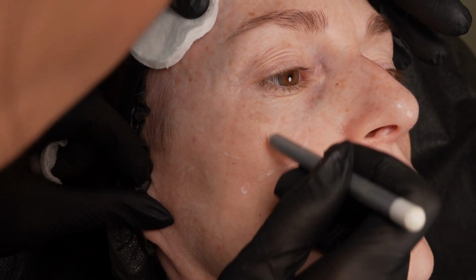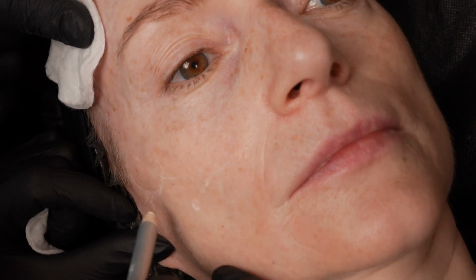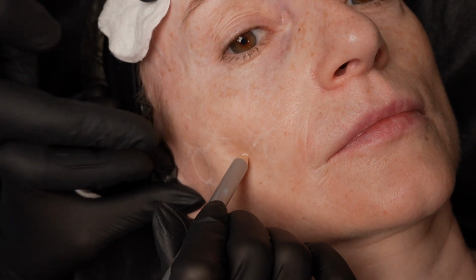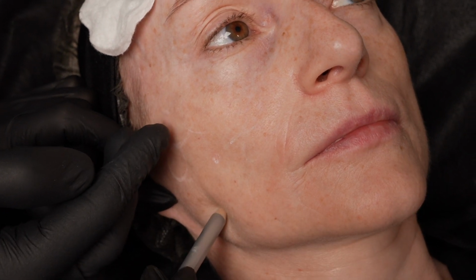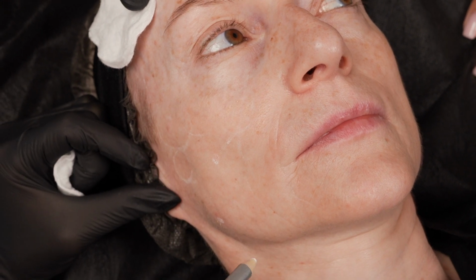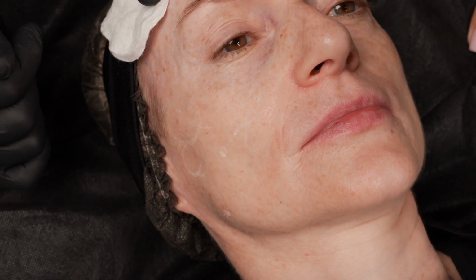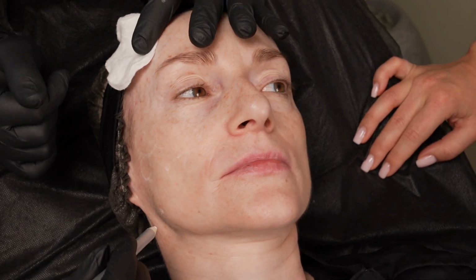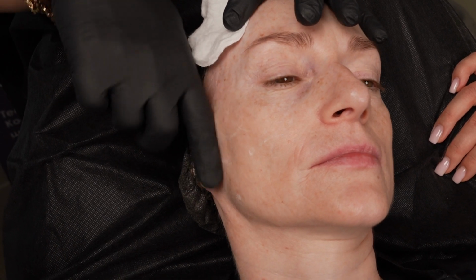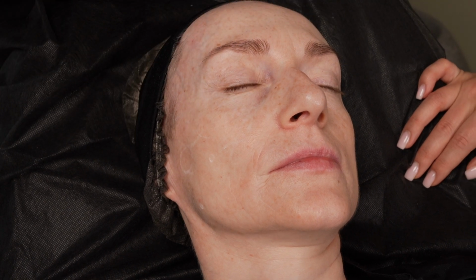And she wants to correct from this point lateral and medial part of the face. And she also wants to correct the space under the zygoma. Хотела, но сюда не тяжело будет зайти отсюда, и я думаю, что скорее всего... Нет, не будет тяжело, нормально. Ну хорошо, да, можно менять. Вообще вколы можно делать столько, сколько вам нужно, не надо с одной точки пытаться все это скорректировать. Надо поменять, поменяйте вкол. Yeah, if she's going to correct this under zygoma space, then she wants to change the entrance. Good. You can enter from here. You can do like this. You can enter from here. You can do like this. Both is okay. Окей. Perfect.